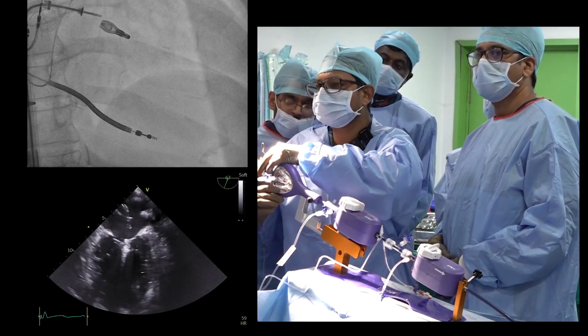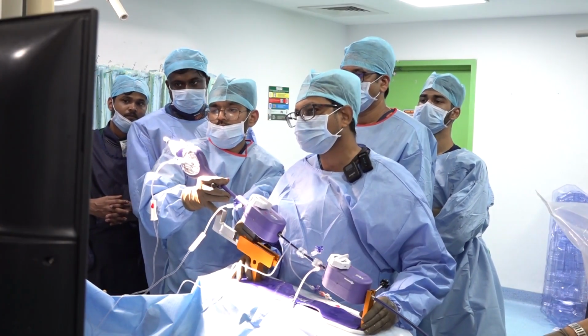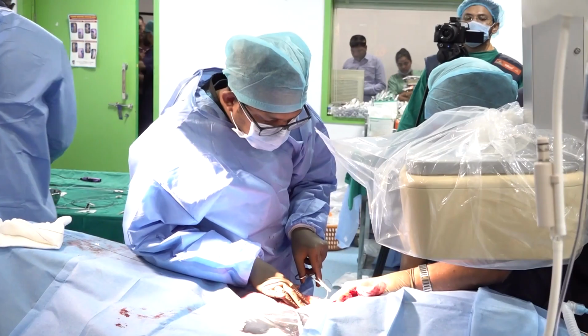Okay. Done, sir. Yeah, perfect, sir. I'm pulling it out. Out. It's out.